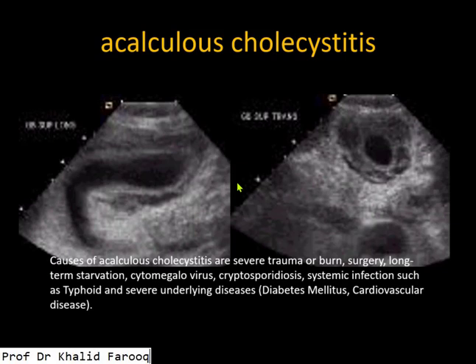Here we see significant wall thickening of the gallbladder and multiple fluid pockets are also appreciated in the pericholecystic space, and we are unable to see any stone in the gallbladder lumen. This is a best example of acalculous cholecystitis, which is usually noted in diabetic patients and in those patients who have some cardiovascular diseases.